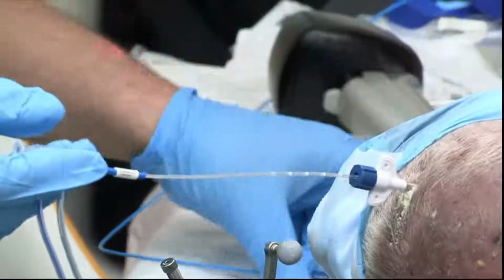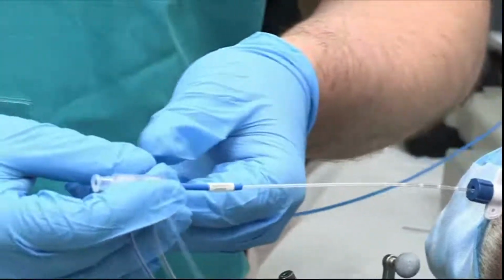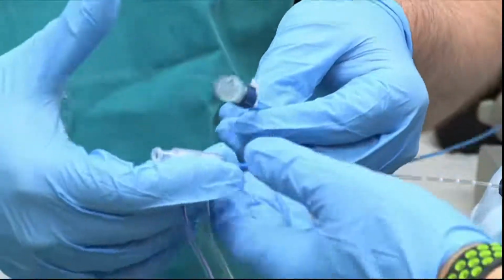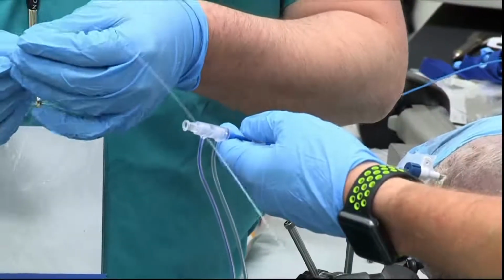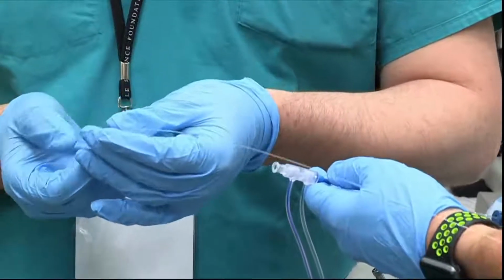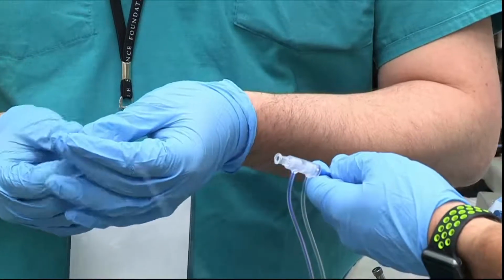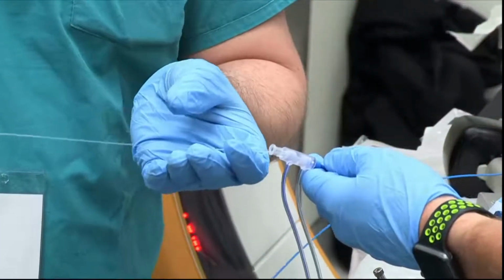So then you're going to have your laser. Either the techs or the reps rather are going to help you, and they're going to mark where actually the end of the laser is. So when this is placed here, and we'll show you that later, you don't want to bend this a lot. You're going to place this all the way down.